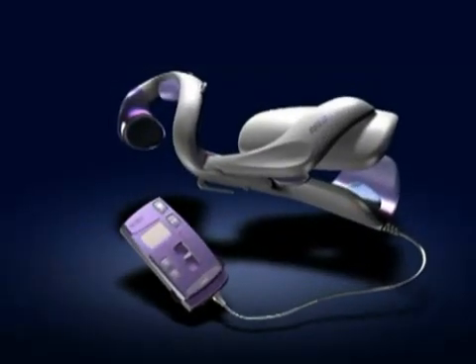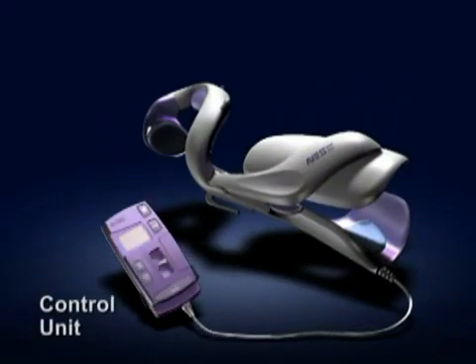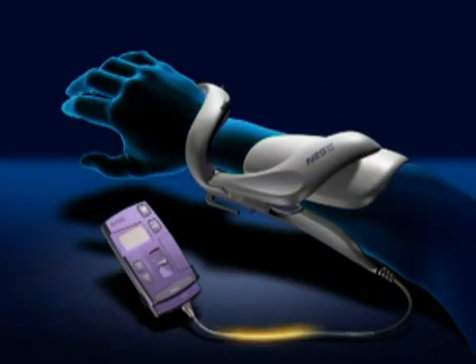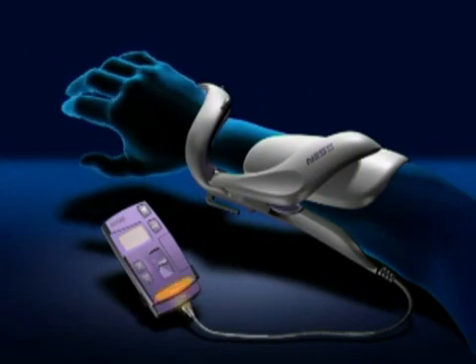The Ness H200 consists of an electronic orthosis and its control unit. The control unit transmits synchronized electrical pulses to the peripheral nerves through electrodes built into the orthosis.